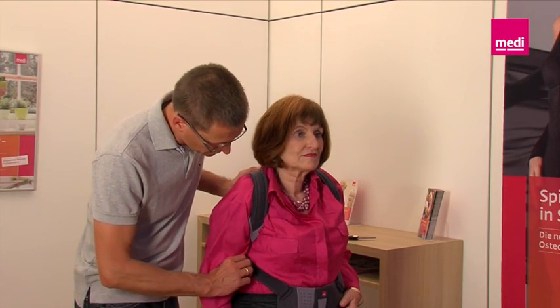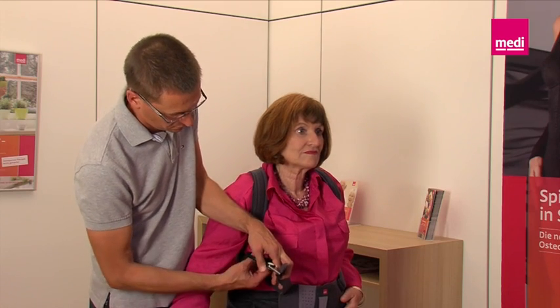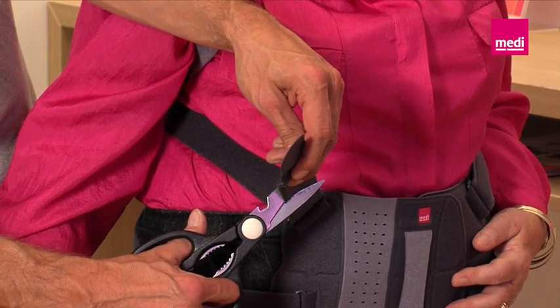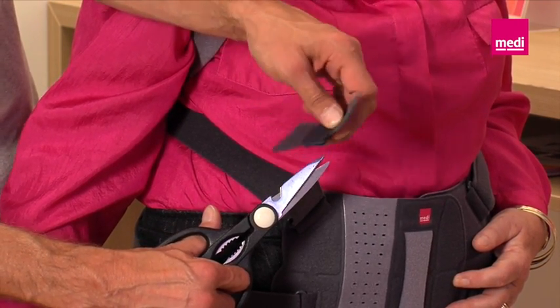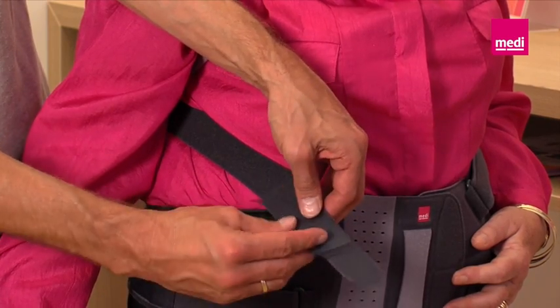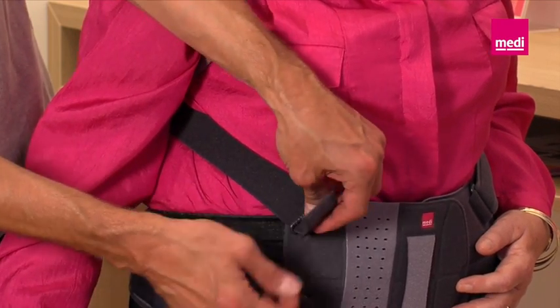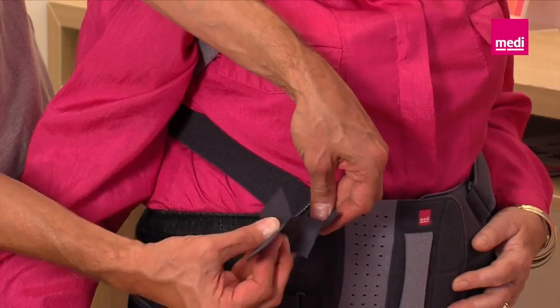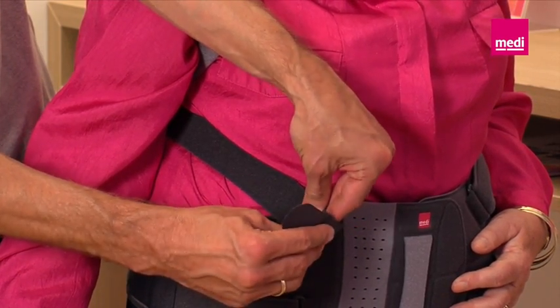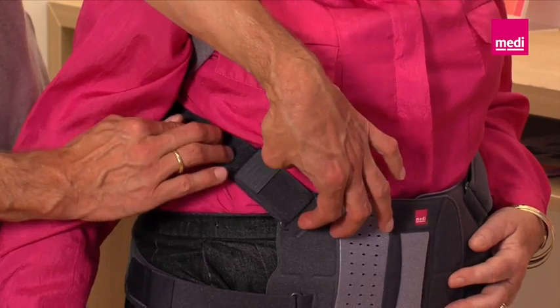Trimming the shoulder straps. After the waist straps have been trimmed to the correct length on both sides, the brace can no longer slip upward. Now it's time to adjust the shoulder straps. As with the waist straps, remove the Y-Velcro fastenings of the shoulder straps, trim the strap with scissors, and reattach the Velcro fastening. Please make sure that the stomach pad is not pulled to the side or upward — the patient should hold the pad. The Velcro fastening of the shoulder strap should now be between the strap loop and the stomach pad, and the strap must be able to run freely through the loop.